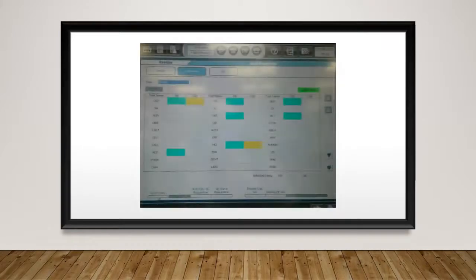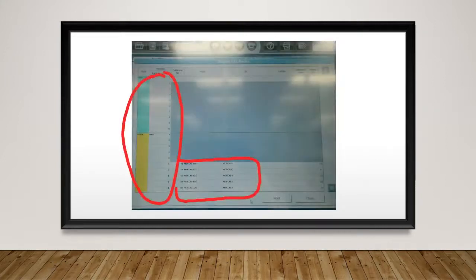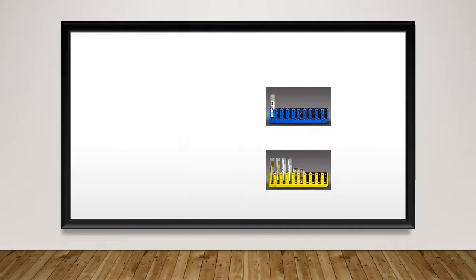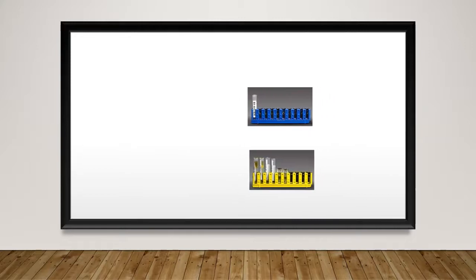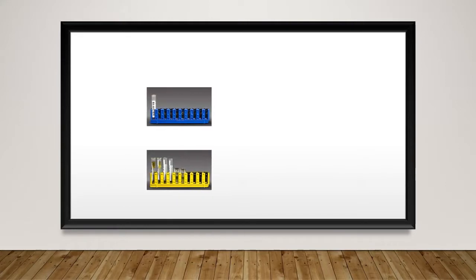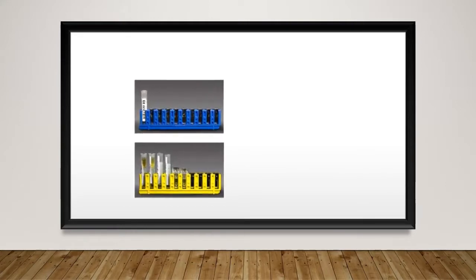Now let's go back to the Calibration tab and select the Display Cal Cup Set on the bottom of the screen to reveal the calibration racks you'll need for calibrations. Then put insert cups into the calibration tubes on the calibration racks and make sure that the insert cups are in the correct positions corresponding to the requested calibrations. Next, fill the insert cups with calibrators.